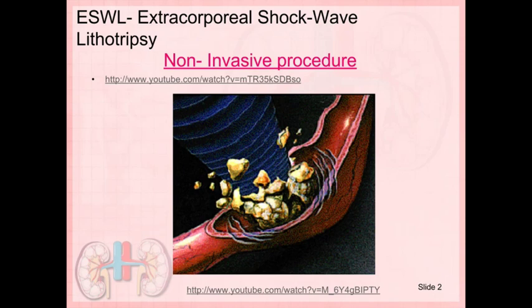Extracorporeal shockwave lithotripsy uses sound waves or shock waves to break up or crush kidney stones, which are then discarded through the urine. This is a non-invasive procedure.